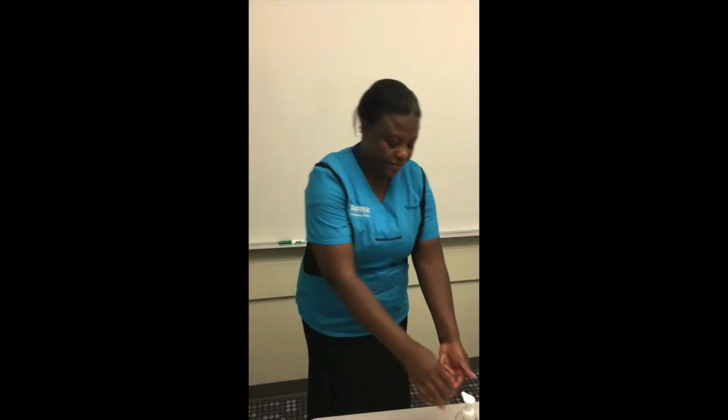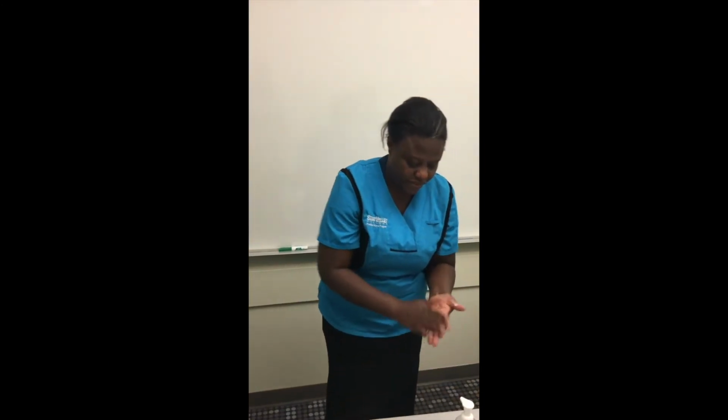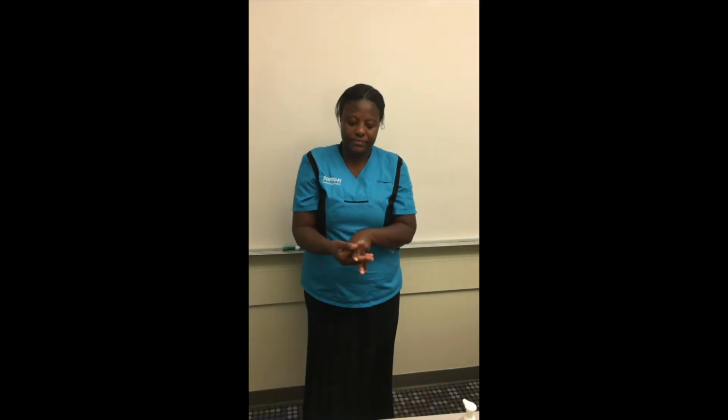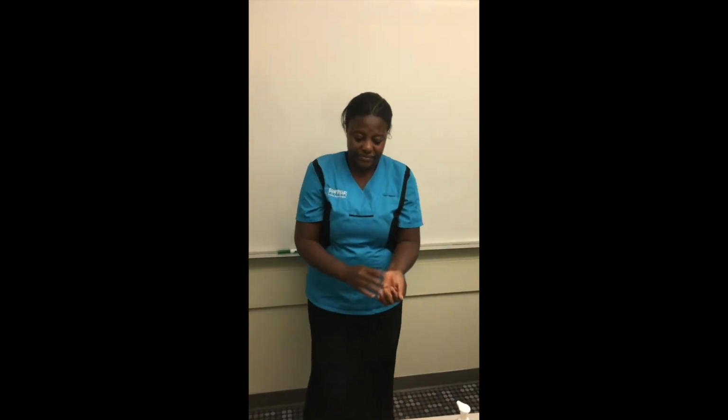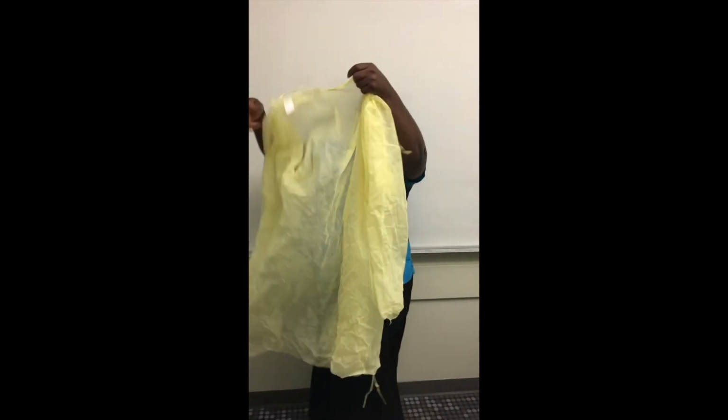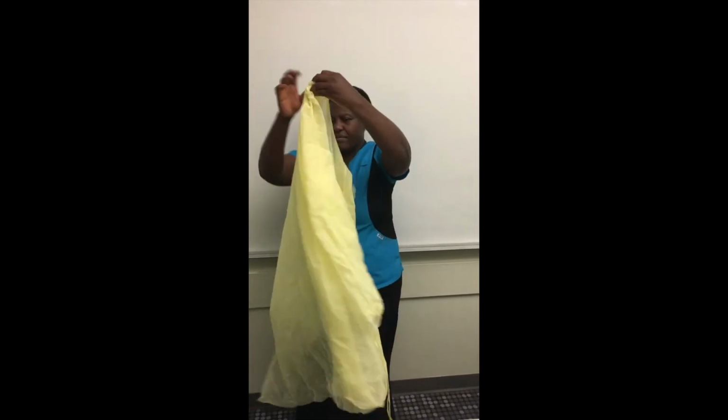Don PPE outside the patient's room. Perform hand hygiene with soap and water or alcohol-based hand sanitizer. Then don the gown, making sure the gown does not touch the floor.